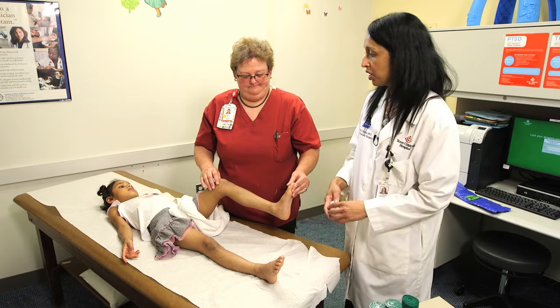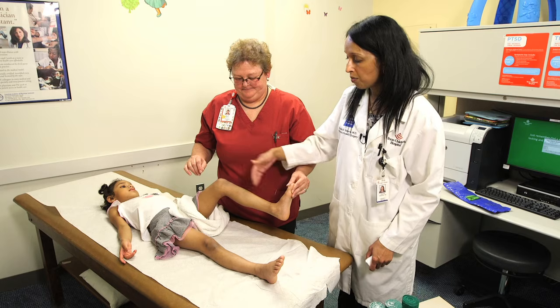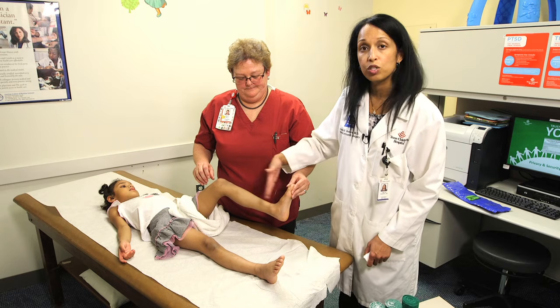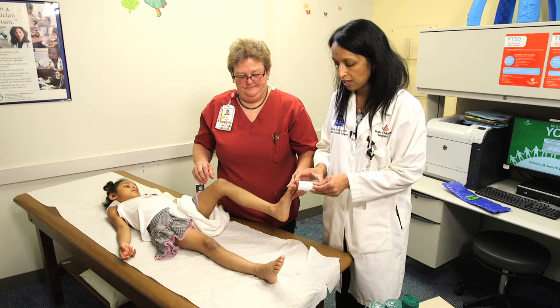So our patient here has an injury to their lower leg. Typically you're going to splint above and below the injury, so the knee and the ankle need to be included in your splint. If your injury is just a foot injury, then you only need to do a short leg splint, so one that's below the knee, but we're going to demonstrate a long leg splint today.